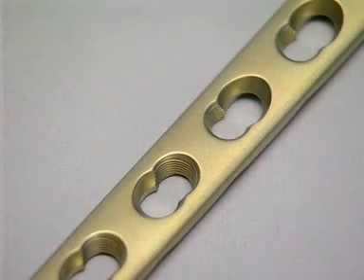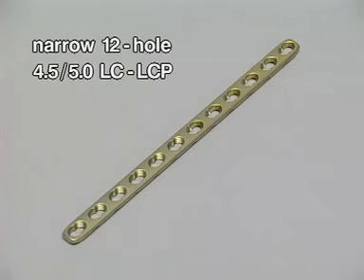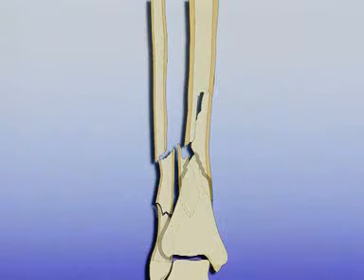For the stabilization of the fracture model, a narrow 12-hole 4.5/5.0 LCP is available for the tibia. The fibula is stabilized using an 11-hole 3.5 LCP. With percutaneous internal fixations with LCPs, the preoperative planning is decisive.